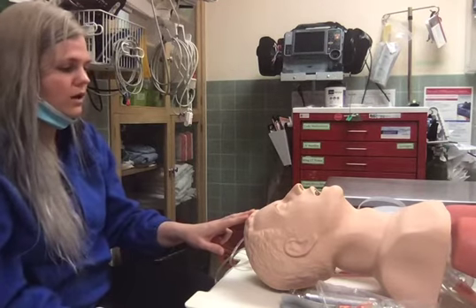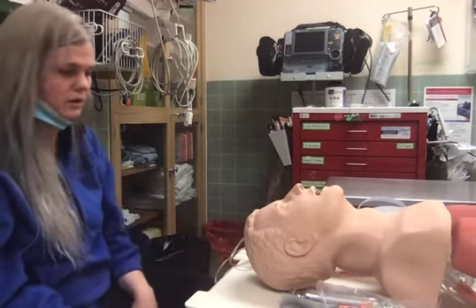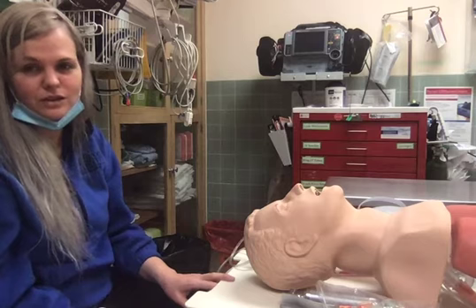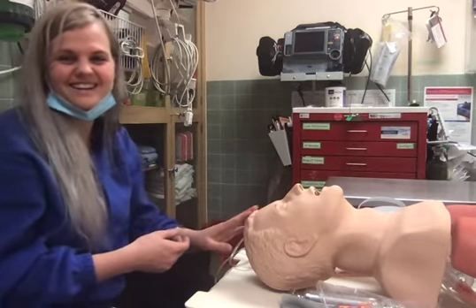And so with that, you get, in my opinion, better outcomes, and it is a little bit safer as far as transport, in my opinion. Again, just my opinion. The pressure support is very accepted for pediatric transports, and so if it's good for kids, it's good for adults too, right?